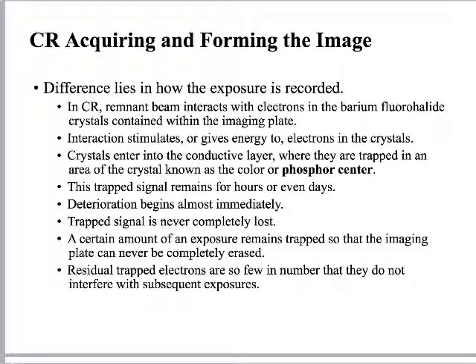One of the things that's interesting about CR, and I know this slide doesn't point it out, but just an interesting bit of trivia, is that it's actually more susceptible to background radiation than film. Back in the days of film, the film was kept in a dark room so no light could reach it, and it was also inside of a lead bunker inside the dark room. Why?